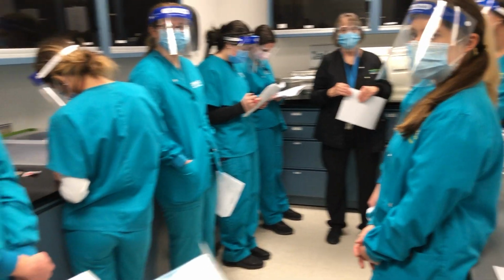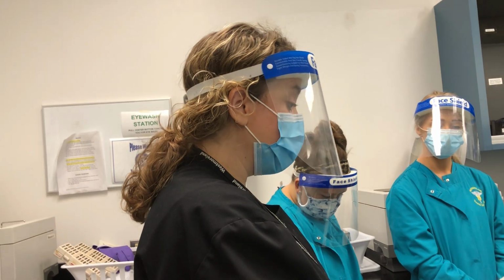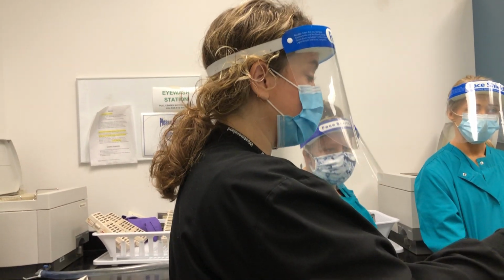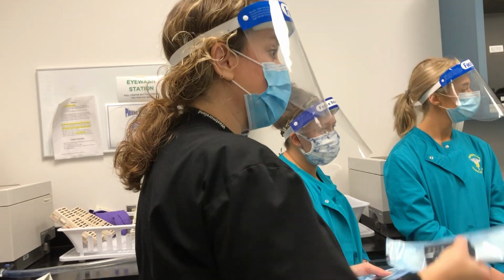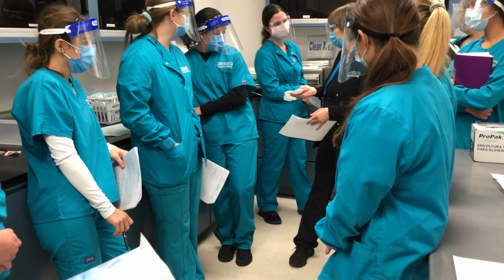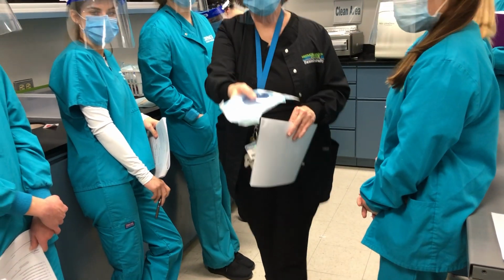And you know the indicators on the bags are a little different. There's one that actually says steam, and then there's one that says EO. So for our purposes, we have steam autoclaves. We look at this pink and make sure that it actually turns brown. She may have one over there that's brown, this one's done. And then do you see the pink beforehand? We'll show her both of them, the before and after sterilization.